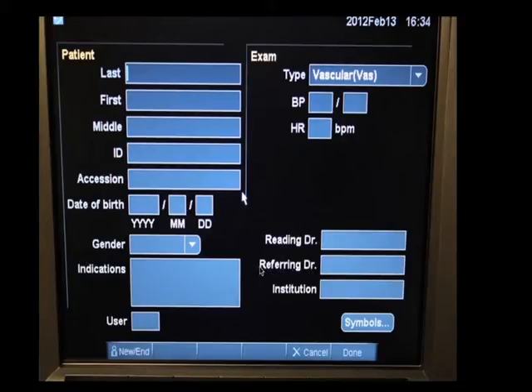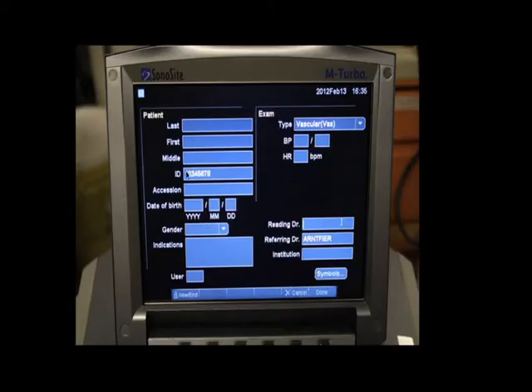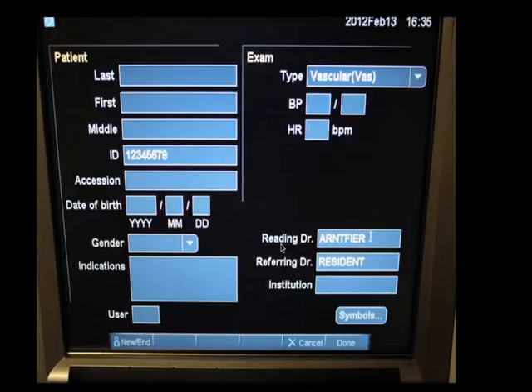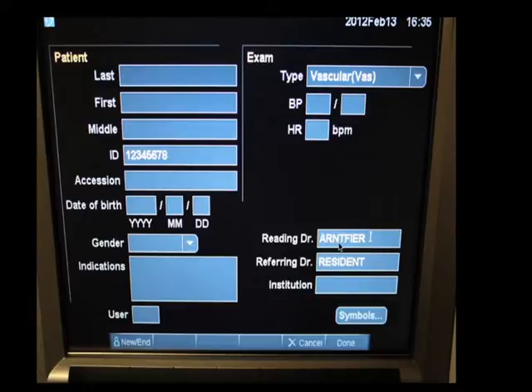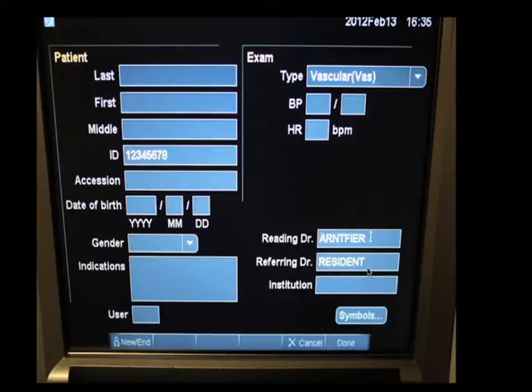Just think of it that you would refer this patient for a point-of-care ultrasound, and you will then honor the referral by doing the scan yourself. Here I've put in a patient's PIN number in the ID field and my Cerner login in the referring doctor field. If you're being supervised by an attending physician who's helping you train, I would encourage you to put their name in the reading doctor field and your name in the referring doctor field. If there are many of you at the bedside doing a scan — for educational credit or simply because it's an interesting case — you can separate your names in the referring doctor field by a comma, and all of your names will be transmitted to the backend server where the images will be linked with your proper full name and user account.